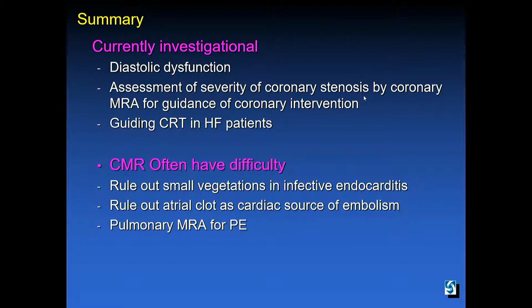It may be easier to understand what MRI is not very good for, and avoid ordering cardiac MRI for these purposes. Like echo, diastolic dysfunction as a condition is challenging. It has low reproducibility that many imaging modalities continue to struggle with, and MRI is no exception. Coronary MRI is currently inferior to cardiac CT in assessing coronary stenosis, except in very specialized centers. Guiding CRT in heart failure patients is still investigational.